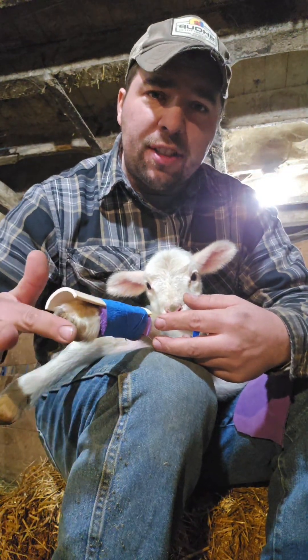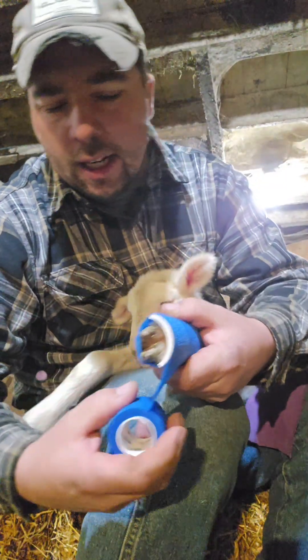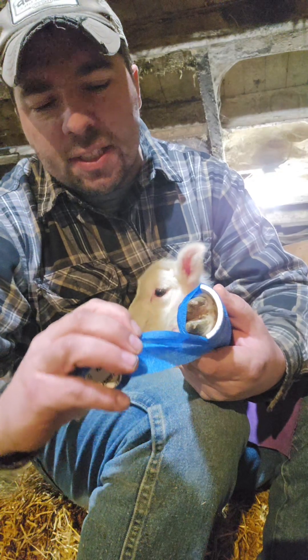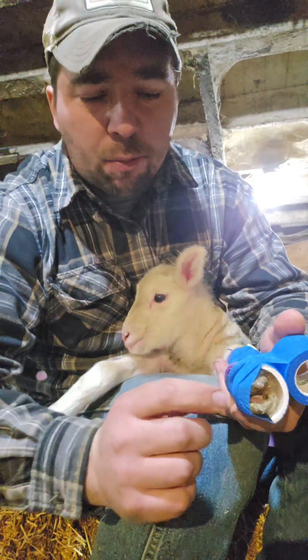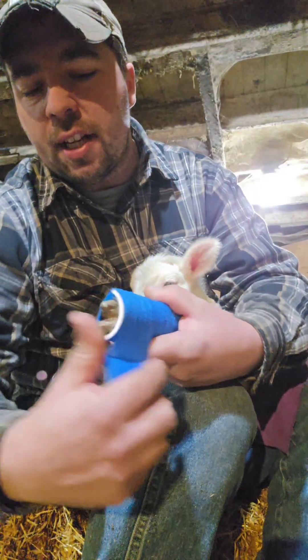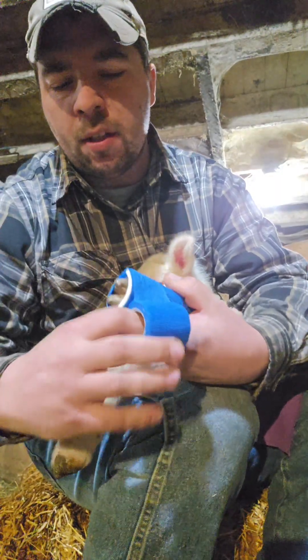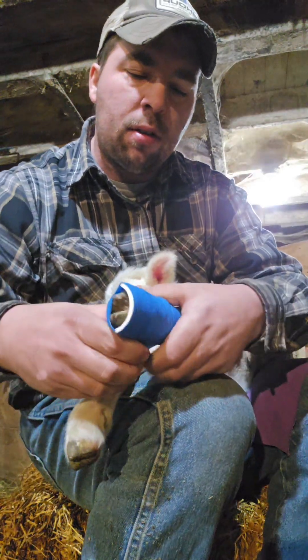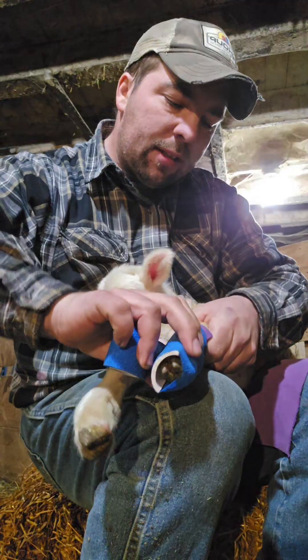Now where we want to put the tension is right here on his hoof. One of the tricks I like to do is when I'm coming underneath the hoof, I'll take that wrap and twist it to make a nice sturdy band that catches him right on the bottom portion of his hoof to put good tension on it. And I'll finish it up with a complete wrap and tie it in to the first, and make sure everything is lined up nice.